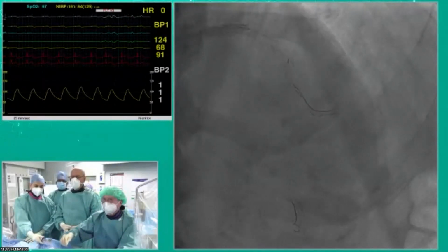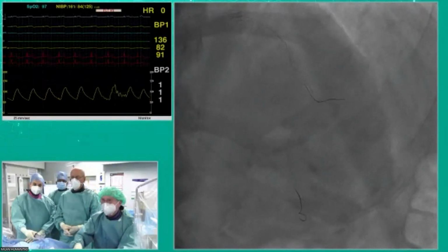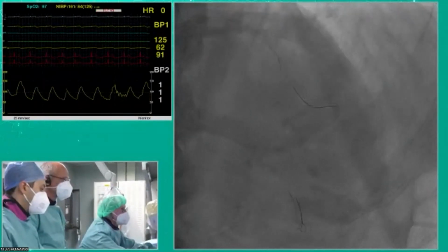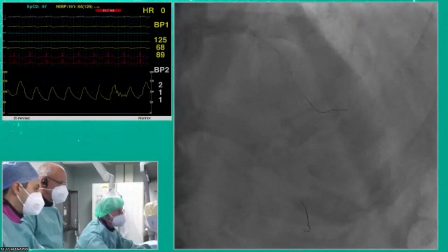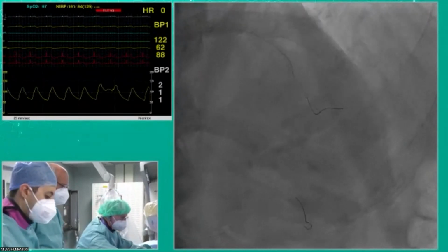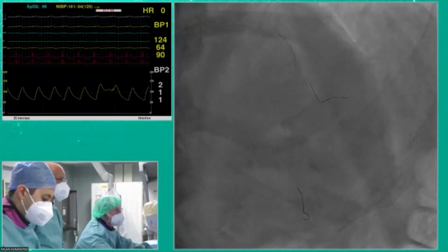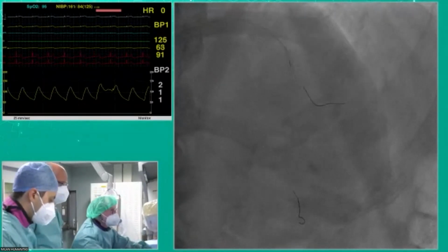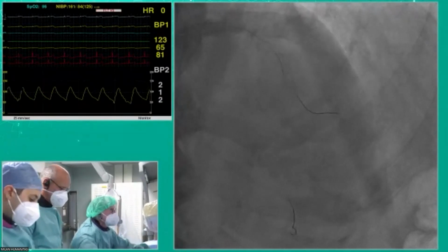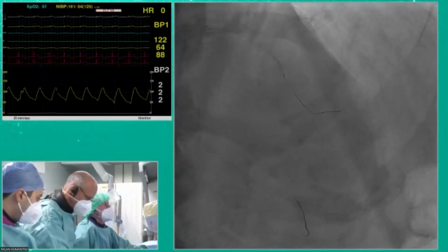To the whole panel and to Antonio: I've used drug-eluting balloons in the ostium of the circumflex on several occasions, including when I left main stent. I've never had a problem. So I don't know the data out there, but it's increasingly attractive, I think. Yeah, the ostium of the circumflex, I agree. The place, if you can avoid a stent.